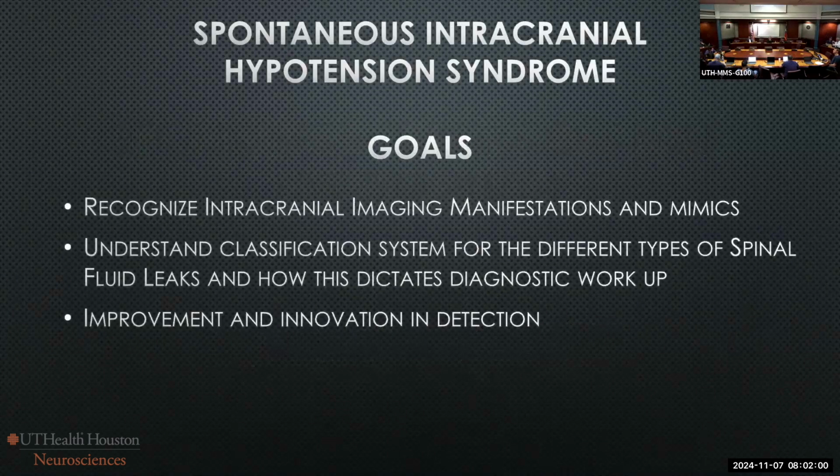Today, my goals are that you will be able to recognize the intracranial imaging manifestations and, importantly, mimics, and understand the classification system for the different types of spinal fluid leaks and how that dictates the workup. Along the way, I'm going to show you new techniques that we've made in improving diagnosis, which has changed a lot in the world of spinal leaks.